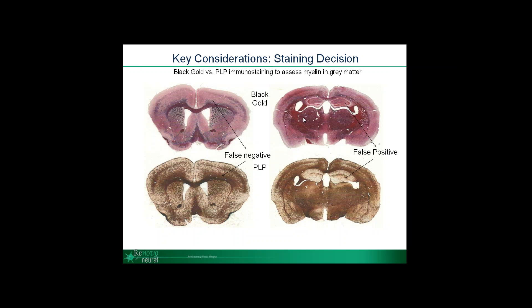In this example, you can see a comparison in adjacent brain slices stained with black gold — a very common myelin histological stain — versus PLP, the major component of myelin. The PLP staining is developed with DAB to give a permanent, high-contrast stain. In both stains there are areas of myelin staining, but when we look more closely we can clearly see within the black gold staining there are both areas of false-negative staining such as in the cortex and also false positives such as in the hippocampus. It's always important to consider the specific limitations of the stains you're using.